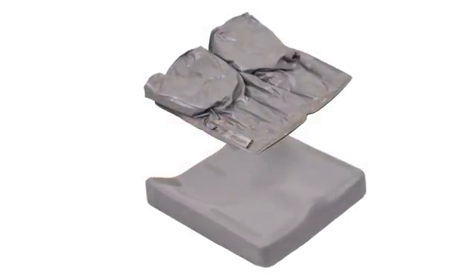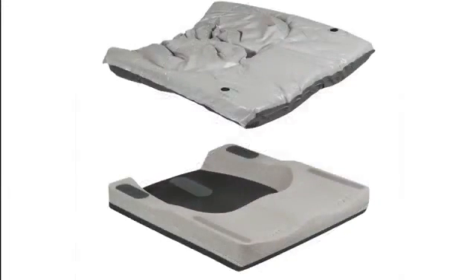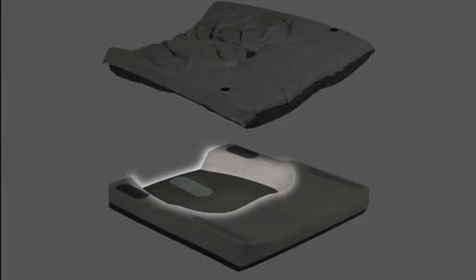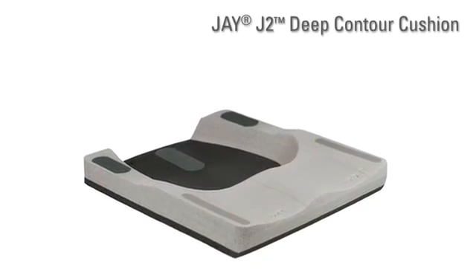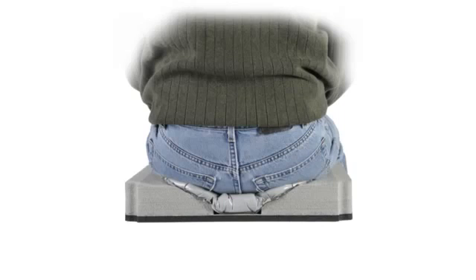The early fluid pads simply covered the entire cushion. But as the design improved, the use of a PLA, or pelvic loading area, to contain the fluid emerged. One of the most successful cushions to incorporate a PLA is the J2 Deep Contour Cushion. This cushion works great for most users.